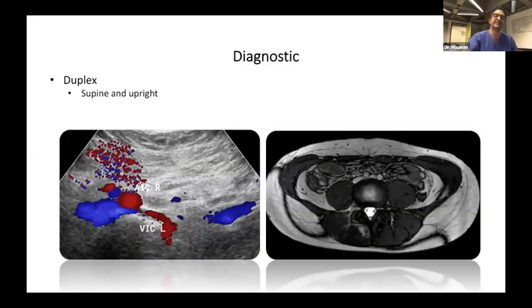So again, a young patient with so-called May-Thurner, the compression in the confluence of the common iliac vein on the left side. I just want to stress the supine and upright position. In nearly every young lady who is thin, you can create with really small, slight pressure a May-Thurner point. You can compress the vein just by putting the probe on the abdomen. So it is very important that we prevent this problem and perform a duplex in supine and upright position in order to say if there is a real May-Thurner or not.